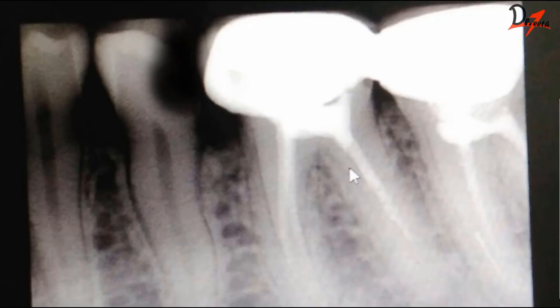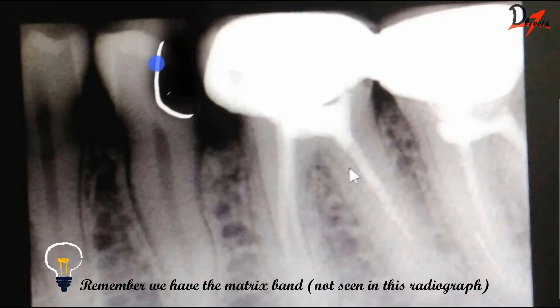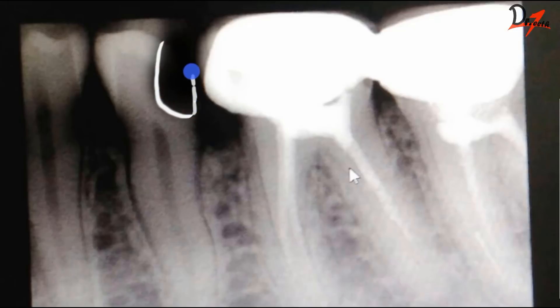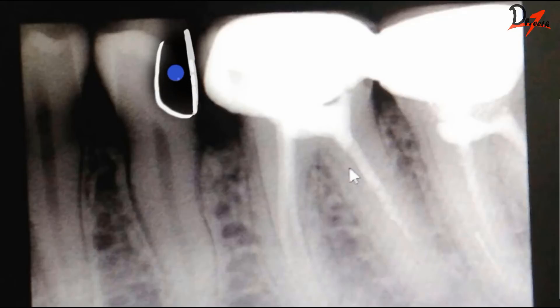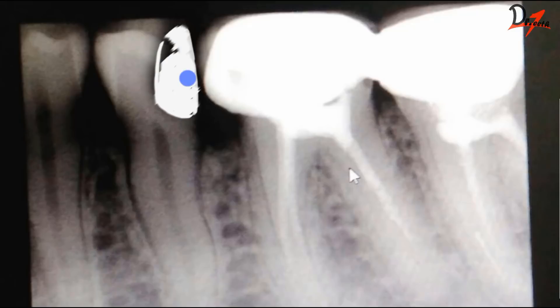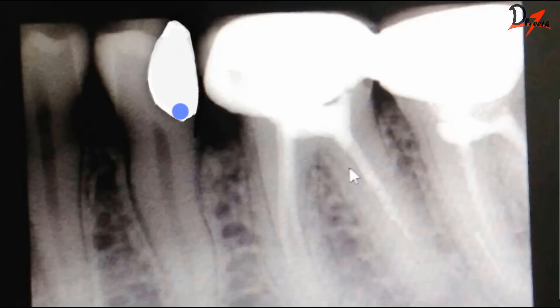A drop of flowable composite was placed, evenly distributed, and cured. Then packable composite was used to build the proximal wall increment by increment. Once the proximal wall is done, the occlusal part is filled in an incremental fashion.